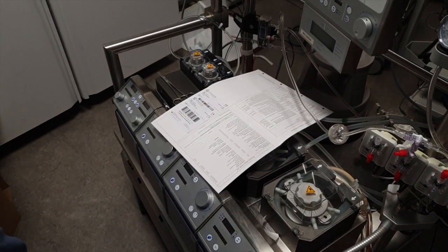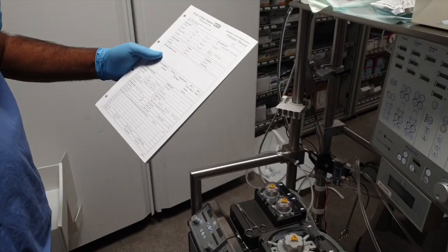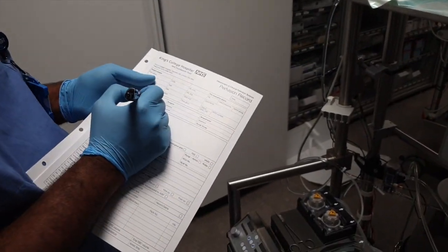Documentation is very important. We record all the details of the disposables, including lot number and expiry date, for traceability, along with the checklist.